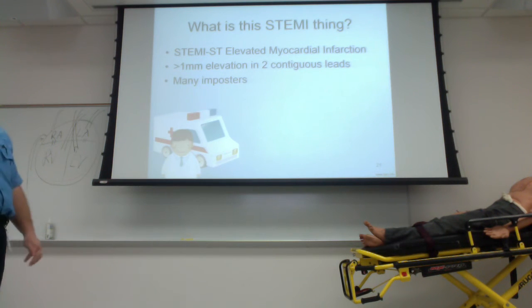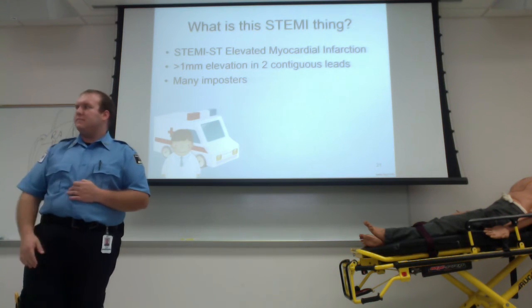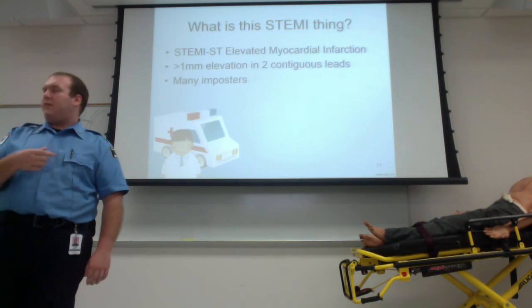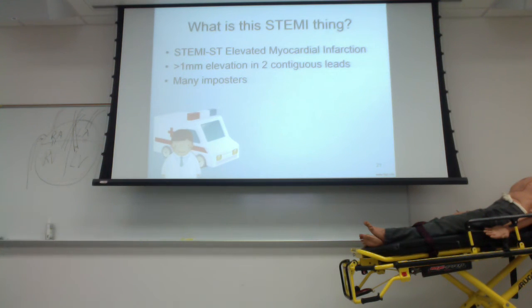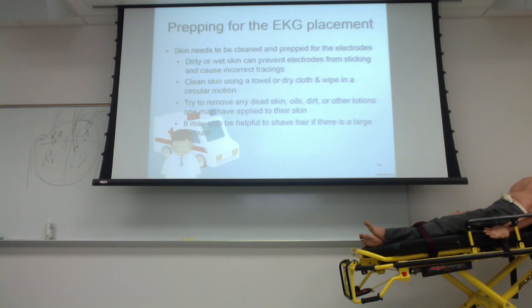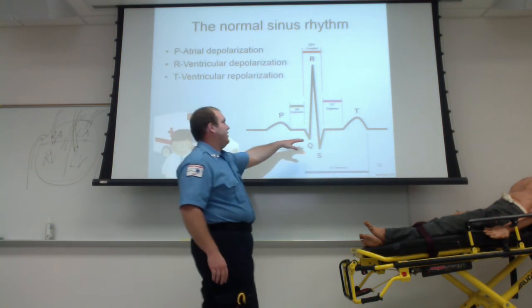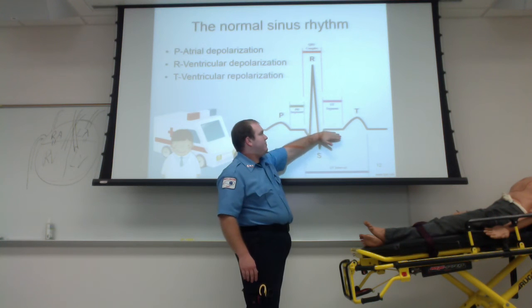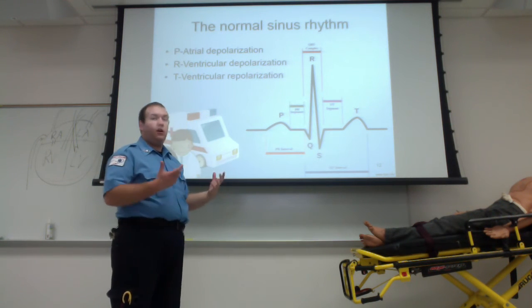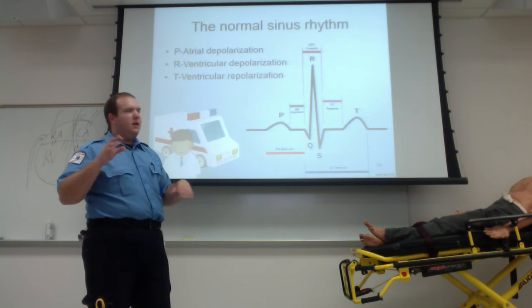So the STEMI thing you've heard about. What truly is a STEMI? Anyone got any guesses? No? Okay. STEMI is an ST elevated myocardial infarction. Let me back up for a second. The ST segment we're talking about is this segment right here. I skipped way over it. Whenever this part is elevated, that's when you start to worry about a myocardial infarction, or heart attack. A heart attack and myocardial infarction are the same thing, different words for it.